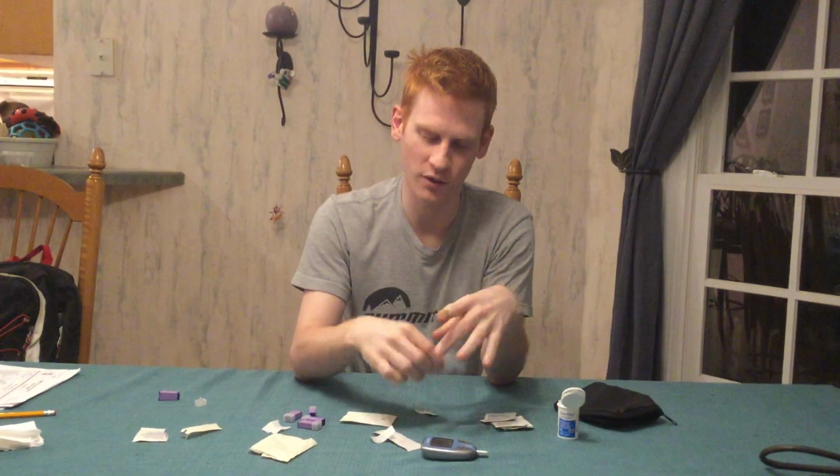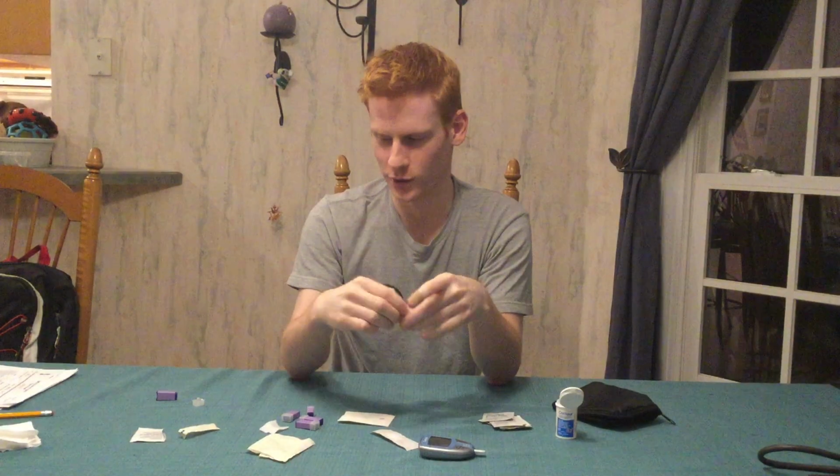So some pearls for checking blood sugars. I've learned that you do not check an automatic blood pressure cuff in the same arm at the same time you are doing a blood sugar stick, because the high pressure from the BP cuff will squirt out blood from your stick, and I have done that to myself twice. So don't be like me, be smart, and don't do it at the same time.